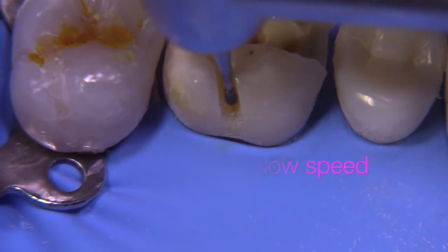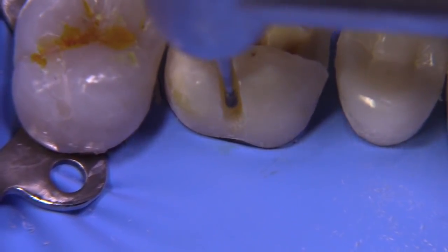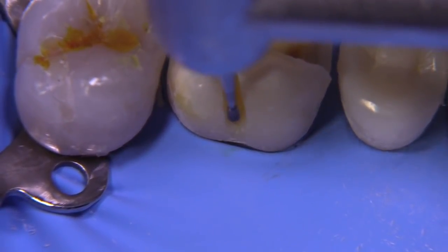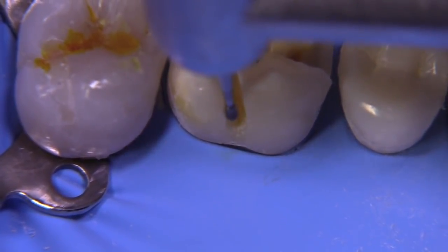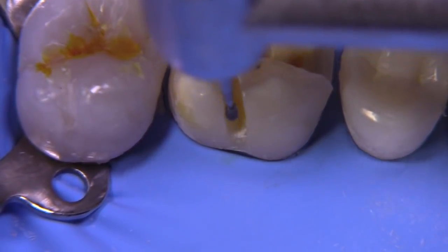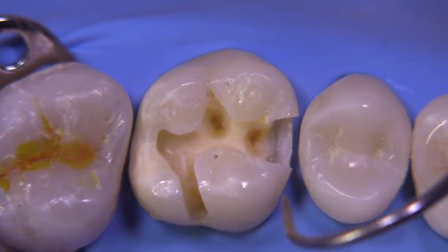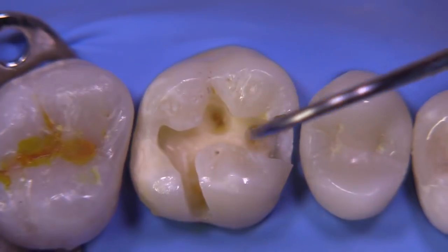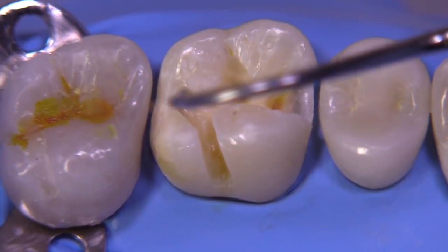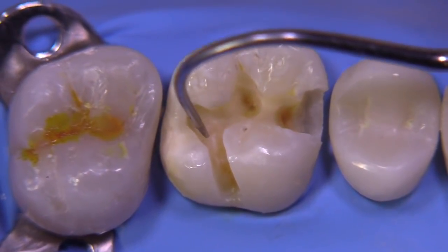Sometimes you can even use a carbide burr in a slow speed to extend into a deeper fissure like we're doing here on the lingual, or you can switch to a smaller round burr because a four round burr would not fit in this area — perhaps a two round or a one round burr. But I'm just using the 330 burr because it's a shape I already had nearby and it works really well. You can then push the explorer against these areas and it's as glassy hard as the adjacent dentin areas.